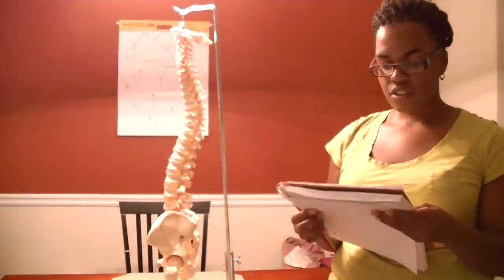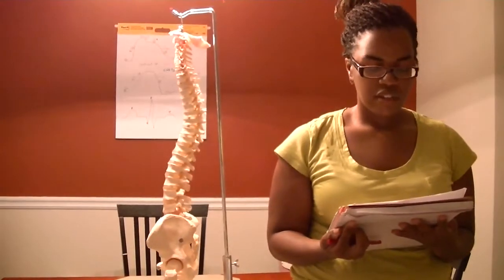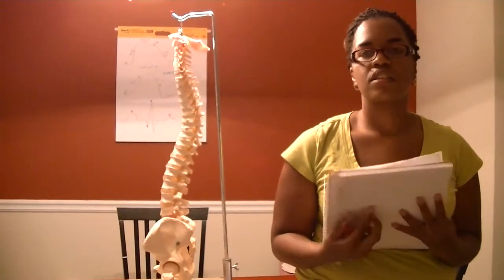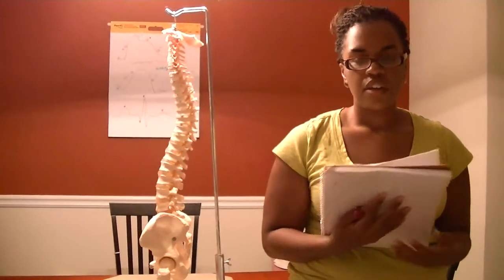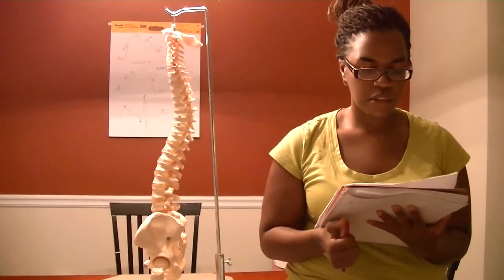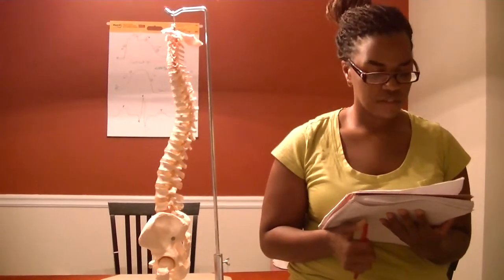That's it for lecture so far. I'm going to go to lab. We talked about a few measurements of some of the structures indicated on our handout. And the first one is for sella turcica. This is a review from last quarter. The A to P dimensions for the sella turcica is 5 to 16 millimeters. The average is 11 millimeters. The S to I dimension for sella turcica is 4 to 12 millimeters. The average is 8 millimeters.